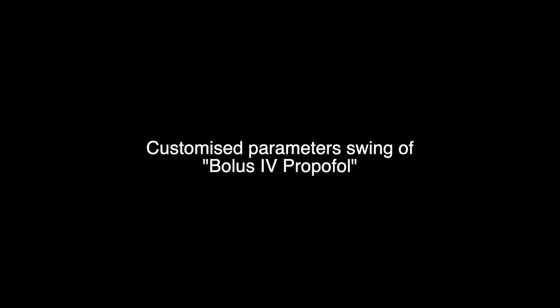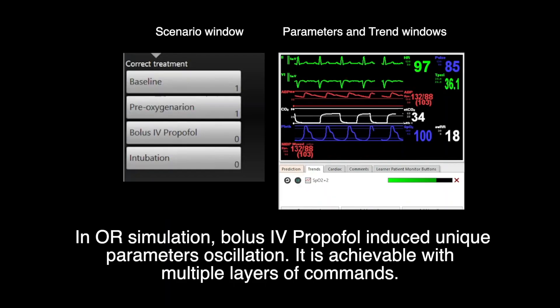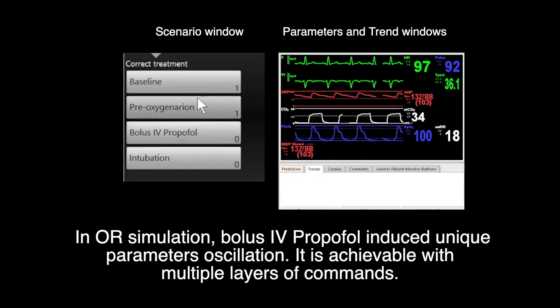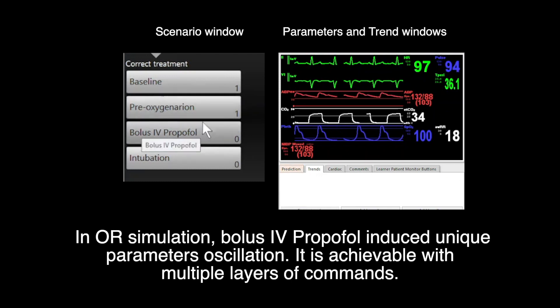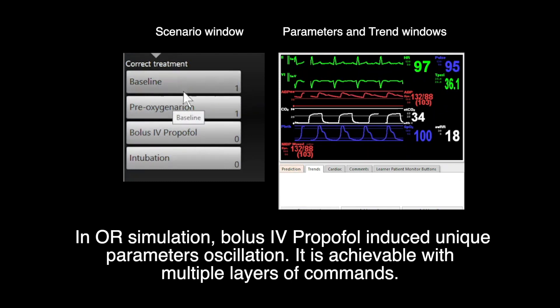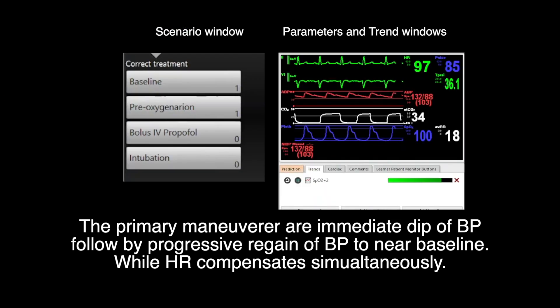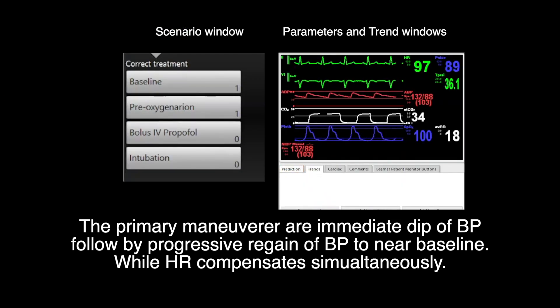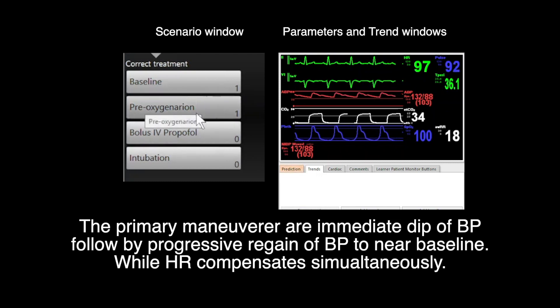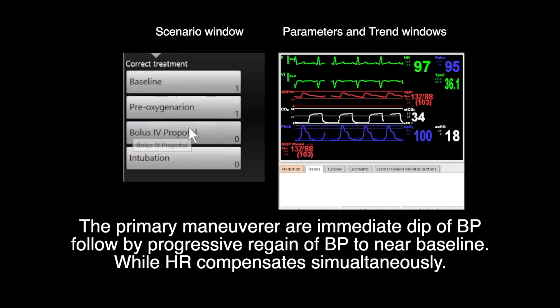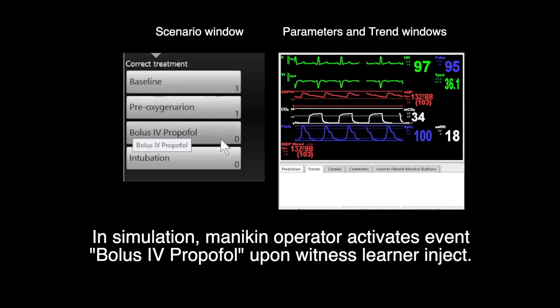Customize Parameter Swing of Bolus IV Propofol. In OR simulations, bolus IV propofol induces unique parameter oscillation. It is achievable with multiple layers of command. The primary maneuvers are immediate dips of blood pressure followed by progressive regains of blood pressure to near baseline, while heart rate compensates simultaneously.